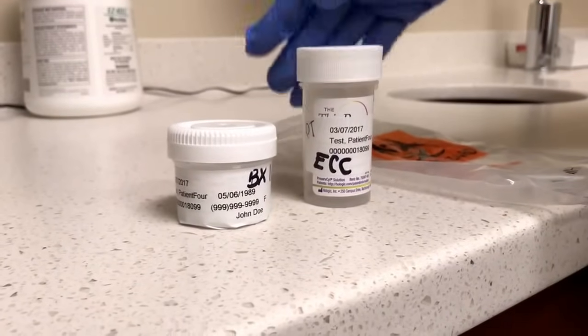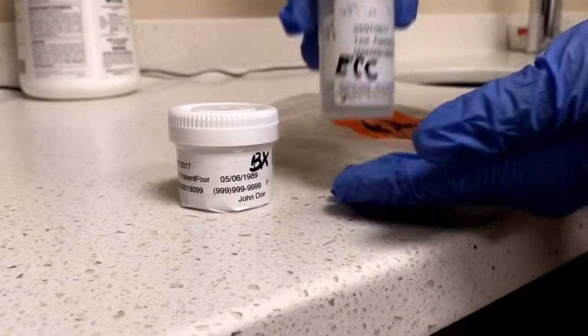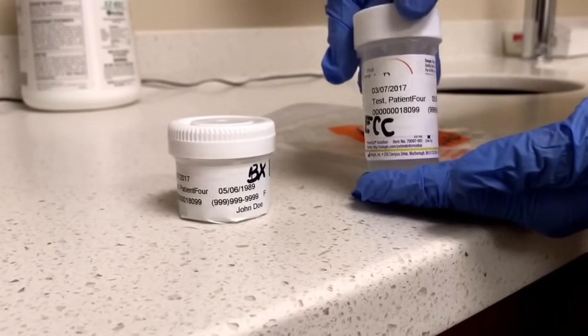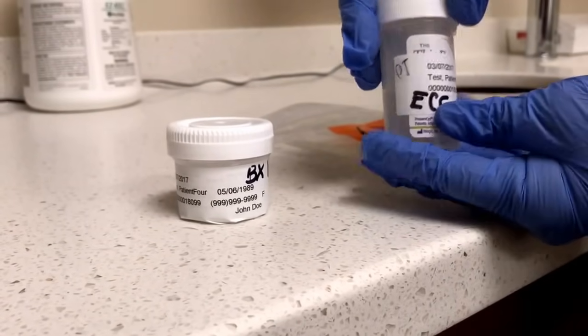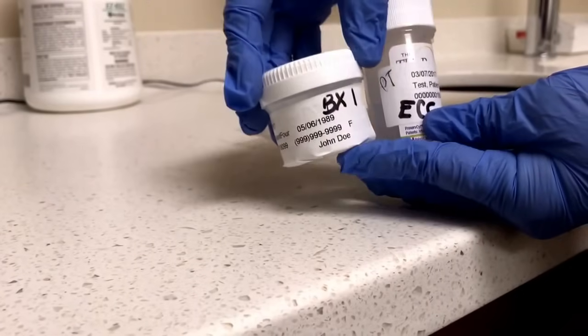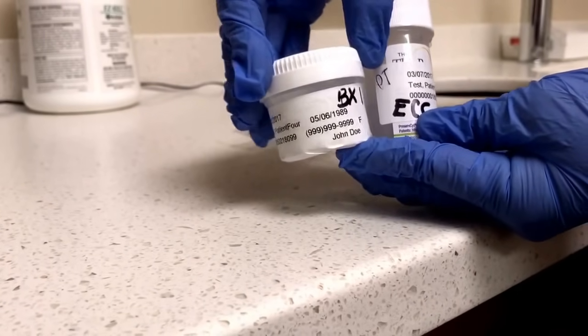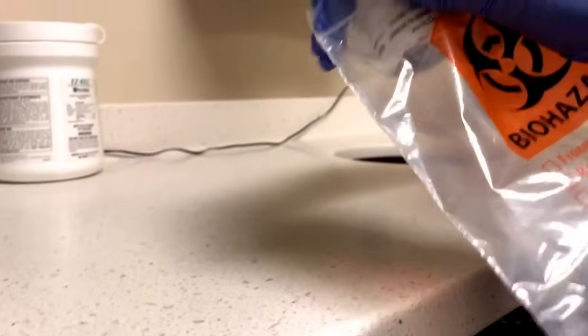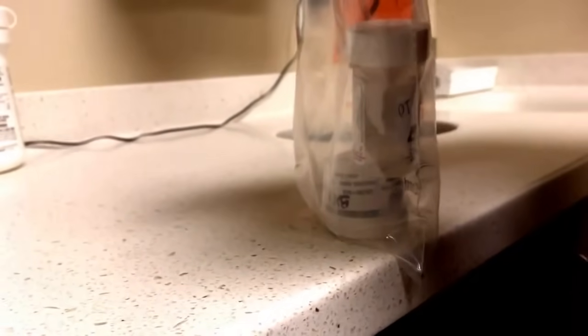After the procedure has been completed, you want to verify that the label is on there and again initialed. You want to make sure that you have ECC written on the first vial, and on the second vial, where that biopsy came from. When that has been completed, you can place it into the bag and print off the requisition when it is ordered.